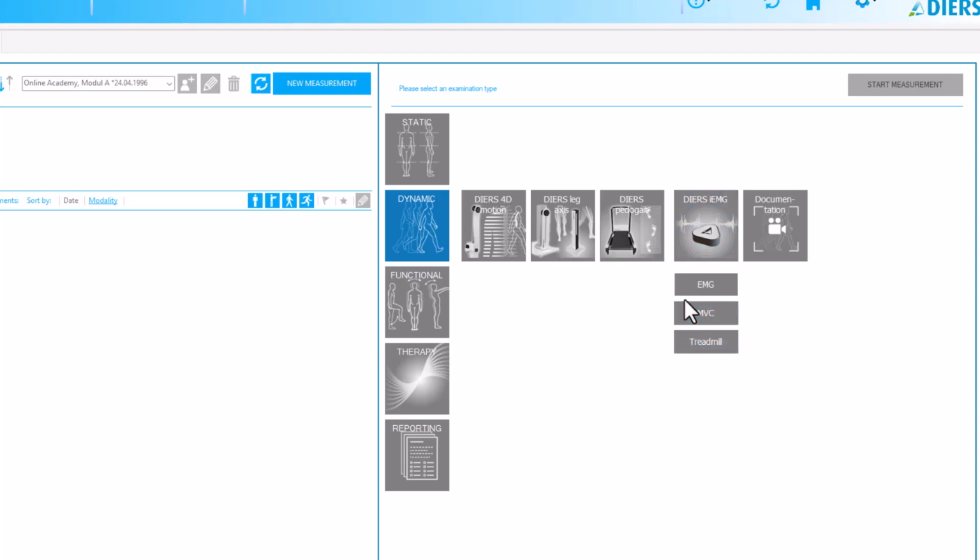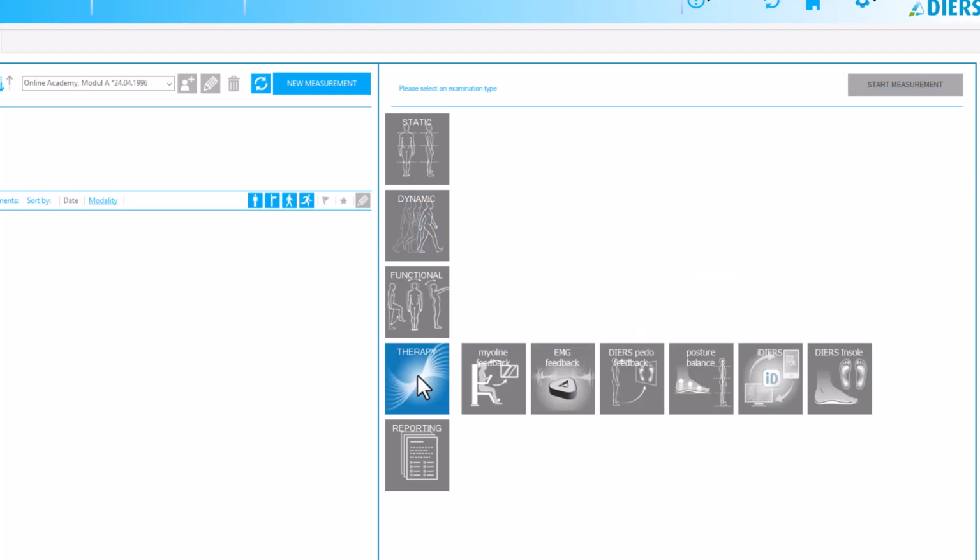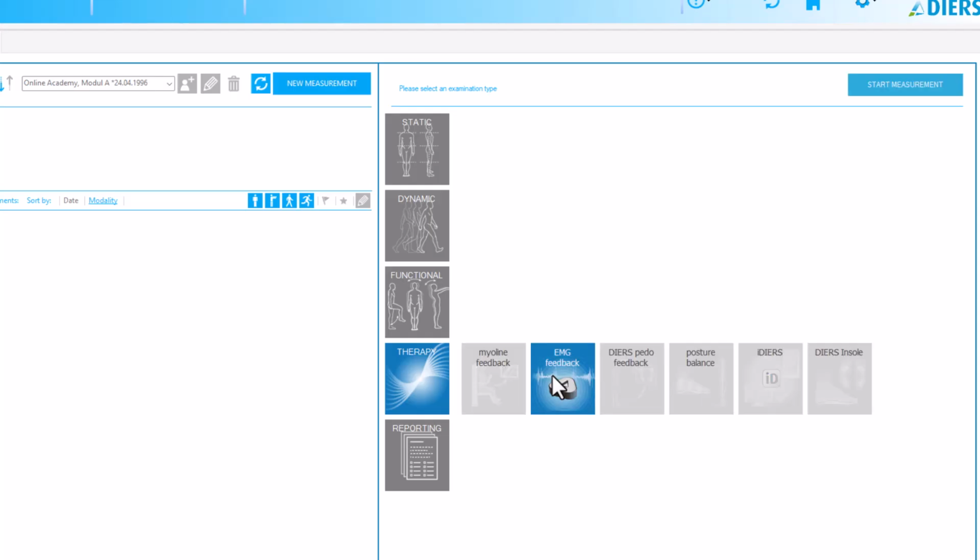The EMG selection includes free measurement of desired muscles, as well as performing and creating guided protocols. This increases the level of standardization, which is very important in EMG and simplifies the comparison of different measurements. The biofeedback examination type focuses on giving patients a better understanding of their neuromuscular activation and thus training the targeted activation or relaxation of selected muscles.